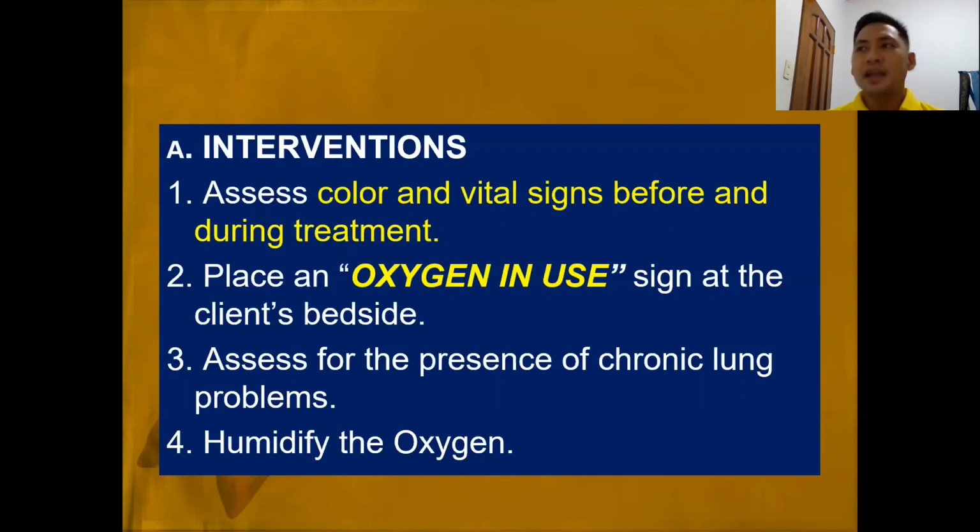But of course, in a very low concentration, like 1 to 2 to 4 liters per minute, a humidifier may not be used because of this low flow oxygen concentration. Then it could not cause respiratory irritation.